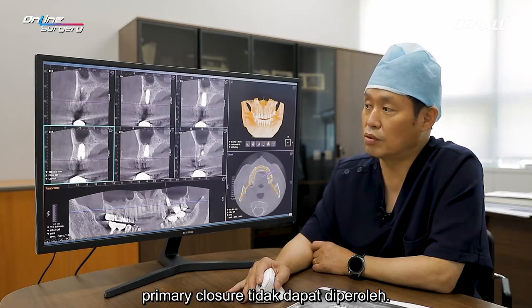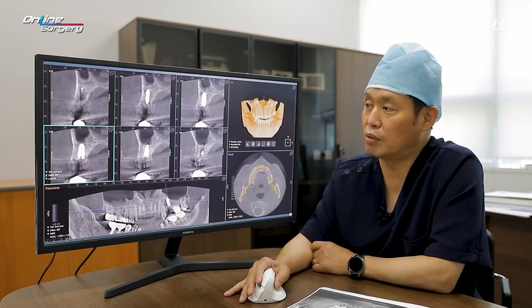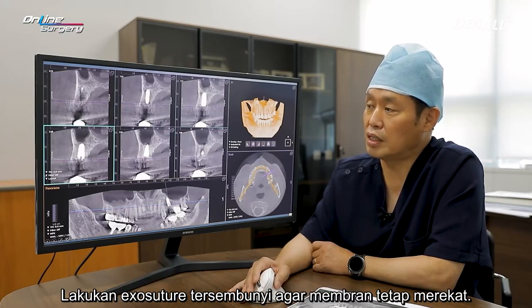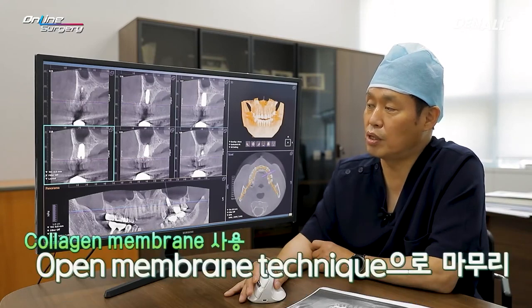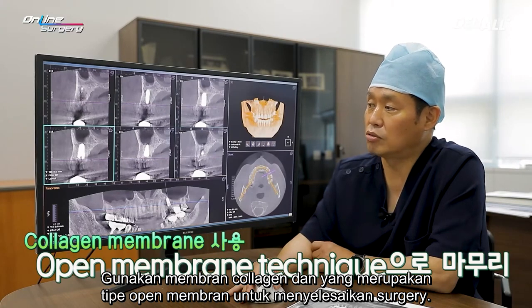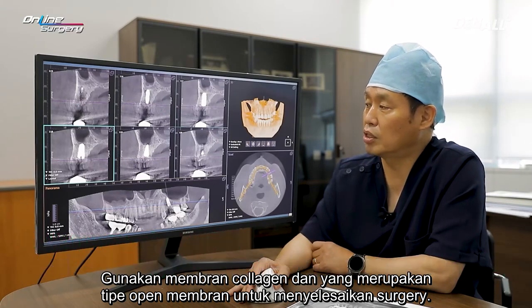Primary closure could not be gained. In areas where graft material was exposed, a collagen membrane was used for coverage. Hidden X suture was done to fix the membrane. A collagen membrane was used, and a type of open membrane technique was used to complete the surgery.